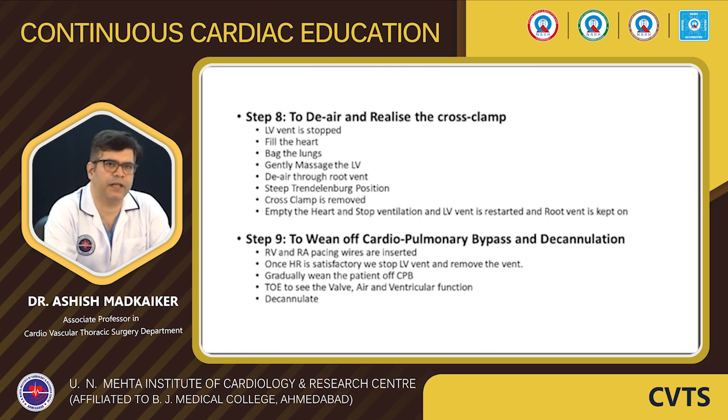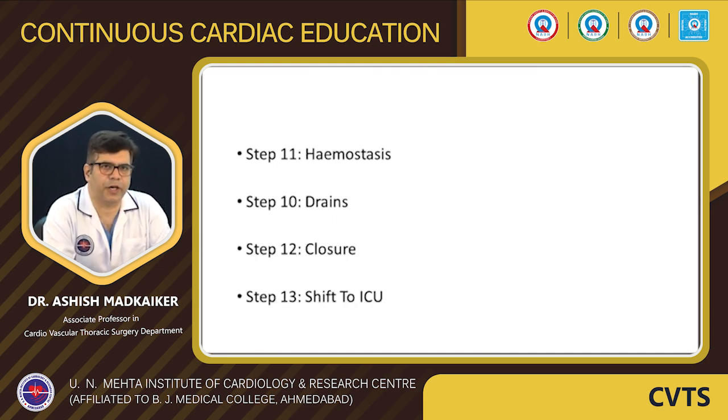It is very important to do TOE to confirm the positioning of the valve, to see if there are any paravalvular leaks, and also to assess biventricular function and status of air. And then if everything looks well, we come off bypass and decannulate the patient in stages. This is followed by thorough hemostasis.